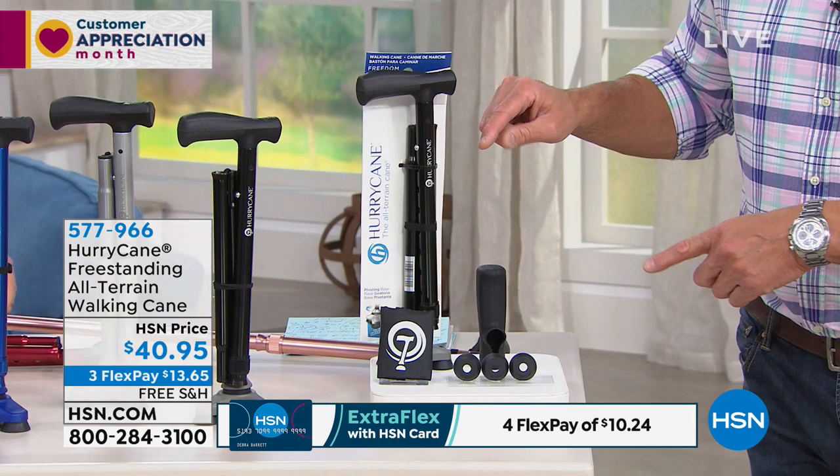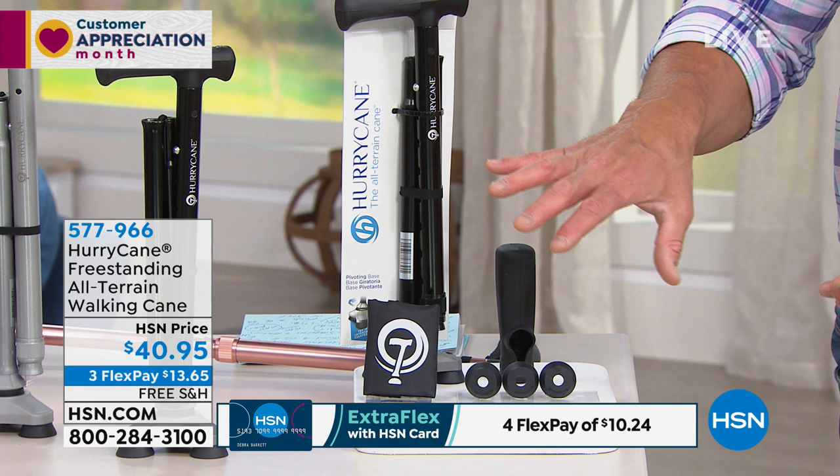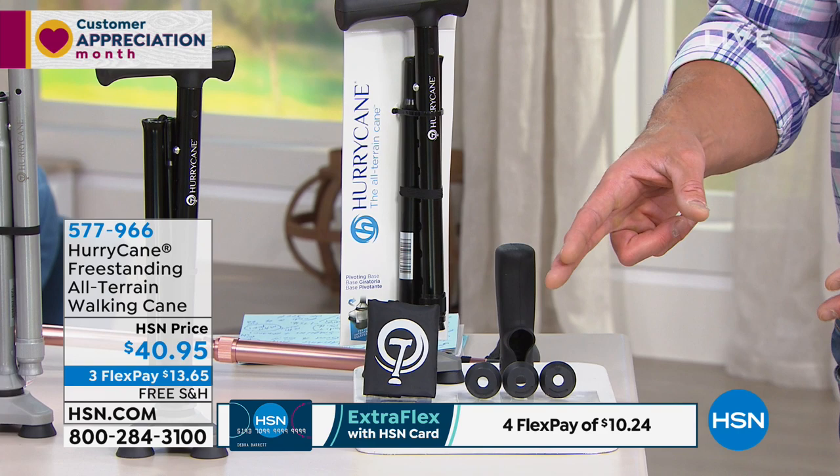We give you that comfort grip, which is a really nice cushion grip, plus a set of extra feet — because you're going to be using this on a regular basis and those are going to wear away just like the bottom of a sneaker. So we give you the extra feet as well. Everything you need to take care of it. This also comes with extra flex, so instead of three flex, you can get it on four flex. And this also includes free shipping and handling.